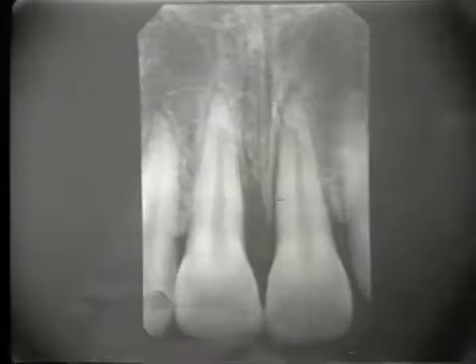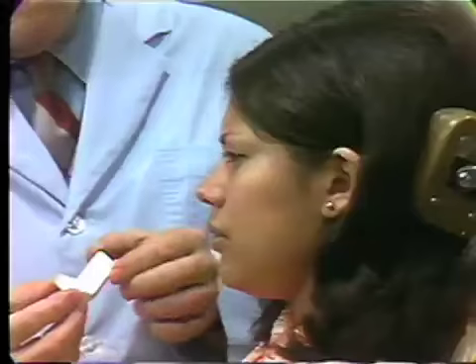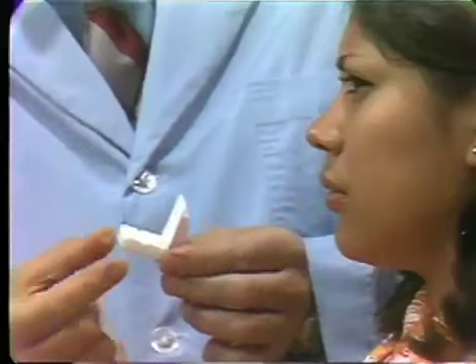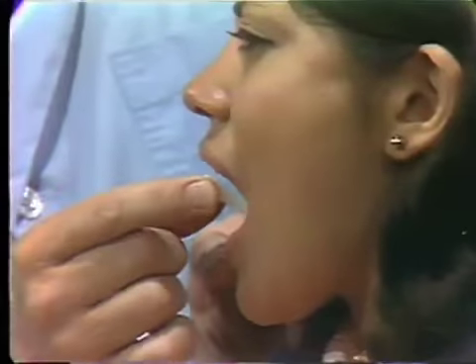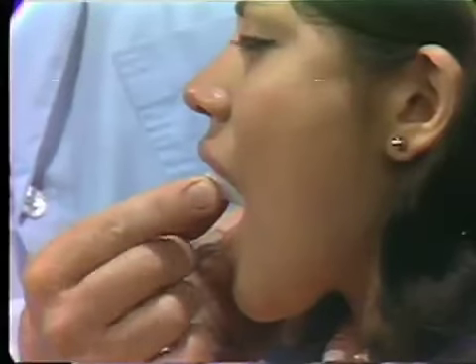Next, we turn to the patient. I have inserted the film in the bite block. We're using the number 1, or rather the number 0 size film. Grasping it thumb and forefinger. Now open please. Place the packet in the mouth so it rests against the roof of the mouth, and then bring the bite block against her teeth.